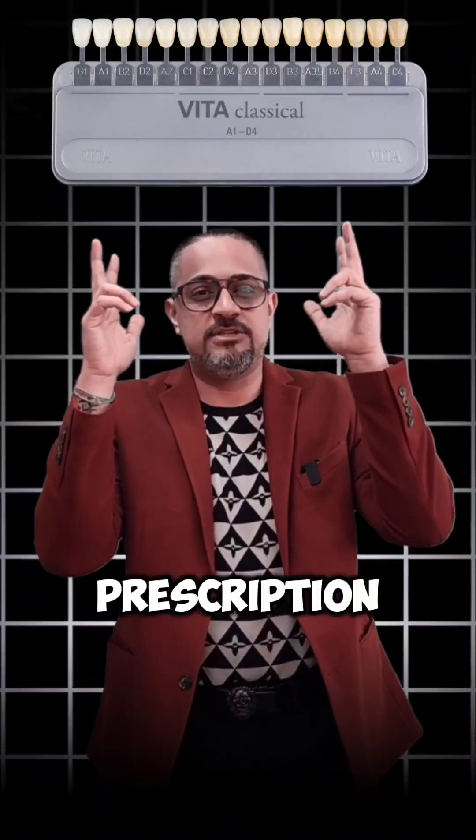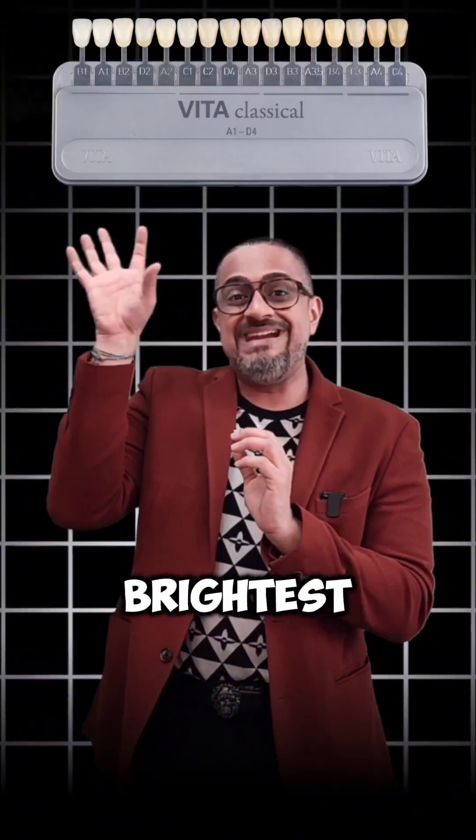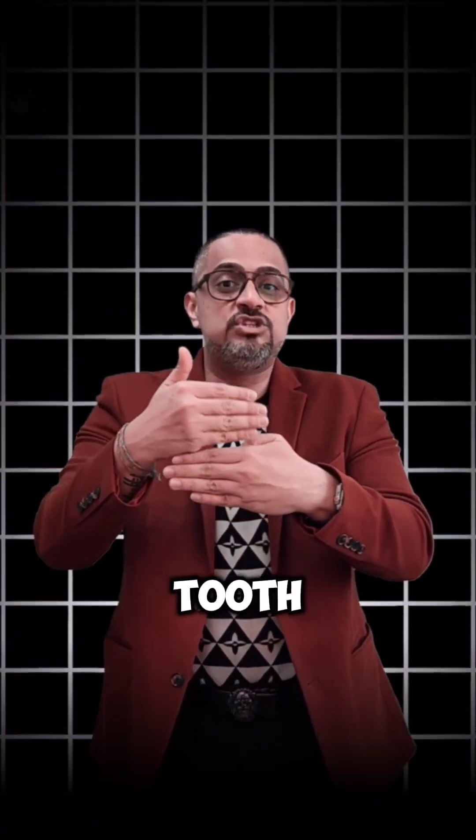Value is the single most important virtue when we talk about shade matching. And unfortunately, the Vita Classic Guide does not work with that principle. So here I'm sharing a value-based prescription — you go from the brightest to the dullest. What you need to do is work with a black and white picture. Hold your shade tab against the tooth, take a picture, and give it a monochromatic look. The shade tab that merges with the underlying tooth shade in black and white tones is the most suitable and should be your shade match.